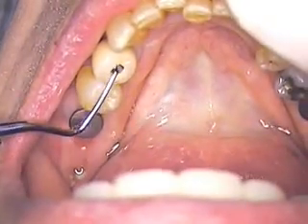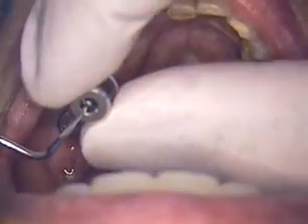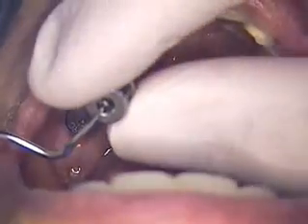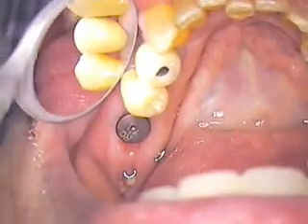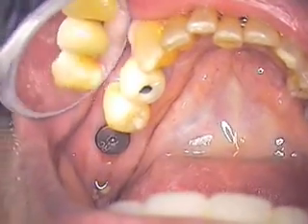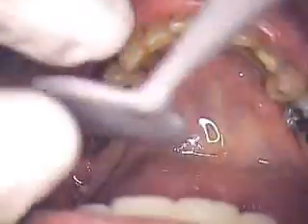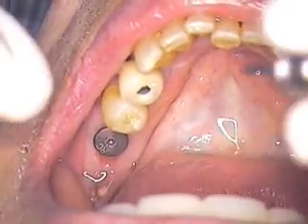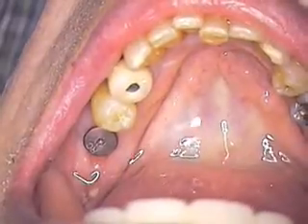I never numb the patient for this procedure — it's just not necessary. If you're pushing too hard, then you do need to relieve your crown work. Here I'm adapting an instrument in the middle of the driver and hand tightening only, very gently. I'm continuing to ask the patient, Ken, do you feel it? — and he shook his head no. Now we're checking for any tissue blanching in and around the crown, and also checking the embrasure spaces to make sure we have adequate embrasure space both buccal and lingually. We'll come back in, hand tighten again, and continue to ask the patient if they're comfortable. We're looking good.